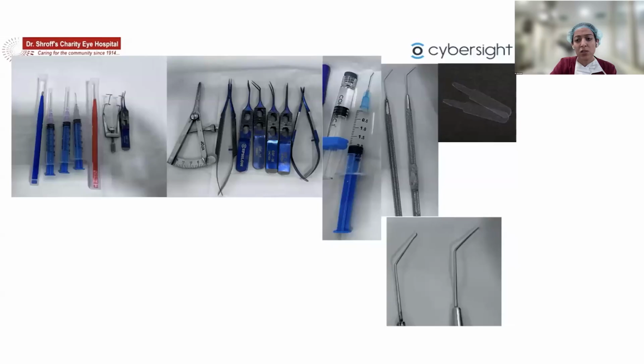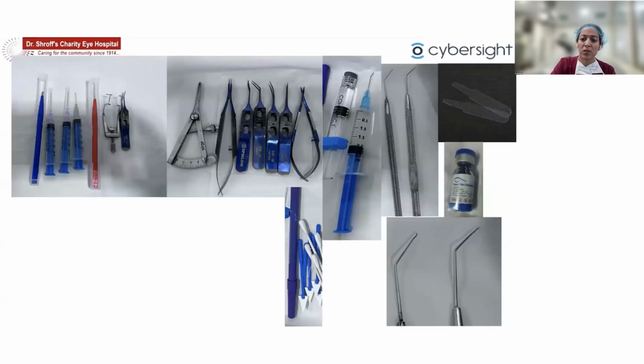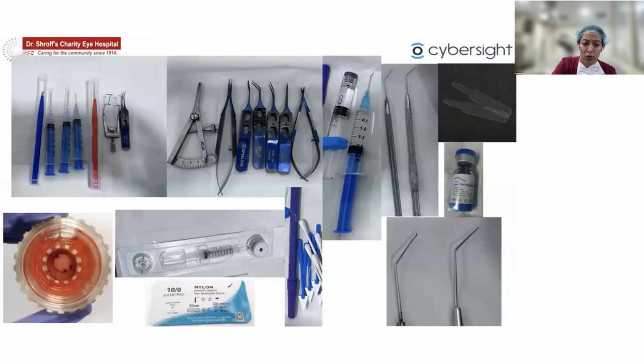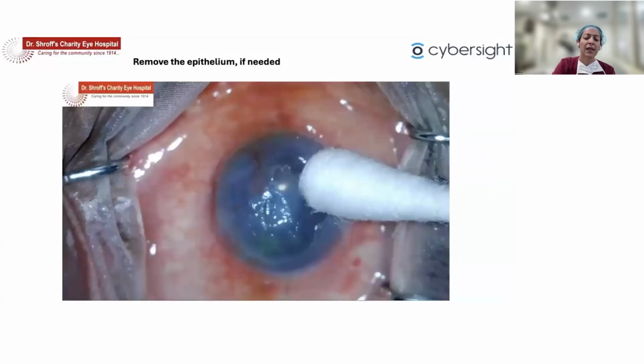The tissue insertion devices could be any based on personal preference; we will be using a Sheets glide, trypan blue to stain the DM, a marker to mark the tissue, wet cell sponges, a suction trephine, 10-0 nylon suture, and the tissue that we will be using during the surgery.